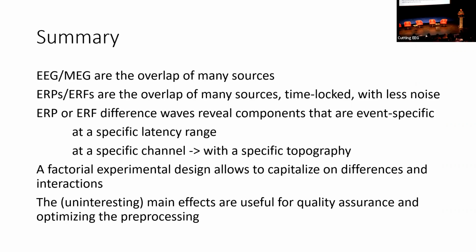Coming back to this AI new way of analyzing data, what do you think we could learn from feeding the AI with stimulus and signal, and eventually this would find the evoked activity? What do you think we could learn from this type of analysis as compared to ERP or ERF analysis?